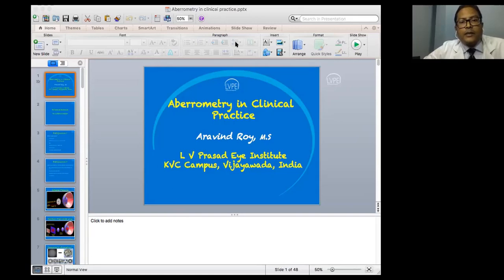Okay, we have some more questions. The calculation of IOL post LASIK. There are several calculations by which you can do. The clinical history method is very accurate. One can also do a post contact lens over refraction, and you can also use for real time the several software that are incorporated in either your G6 software in Galilei, or you can use the iTrace. So there are several such software which are now being incorporated in your IOL calculating units in addition to topography, and you can also use an online Warren Hill calculator to calculate the intraocular lens that you need to implant post refractive surgery.